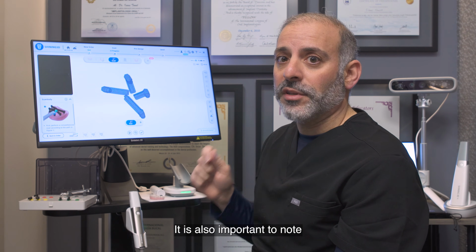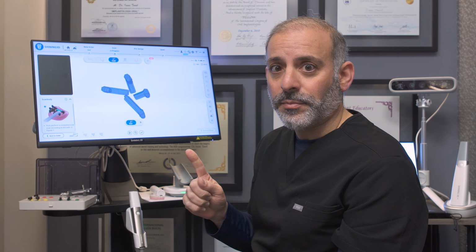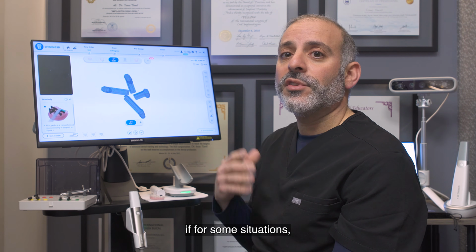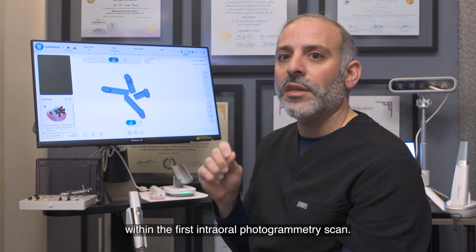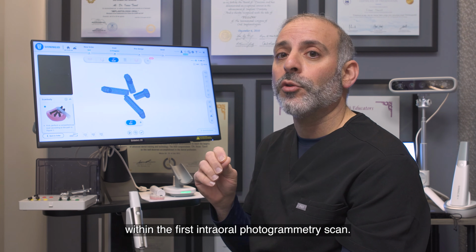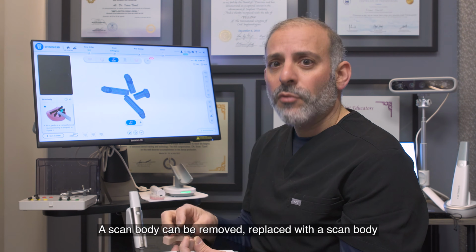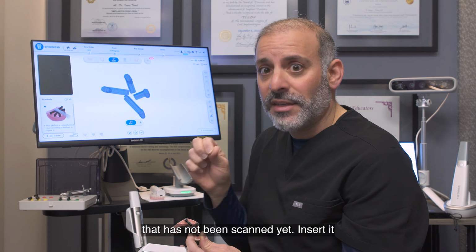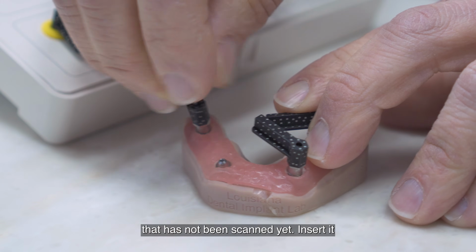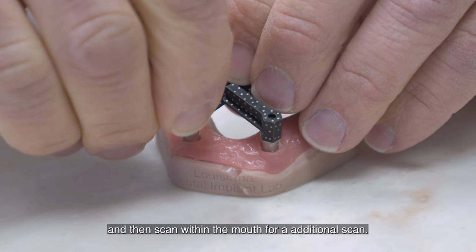It is also important to note that the scan body can only be captured once. If, for some situation, the scan body is unable to be captured within the first intraoral photogrammetric scan, a scan body can be removed, replaced with a scan body that has not been scanned yet, inserted, and then scanned within the mouth for an additional scan.